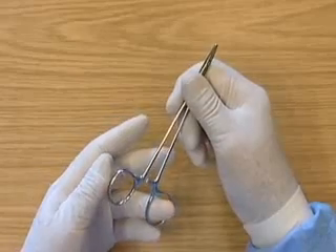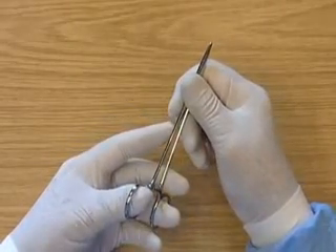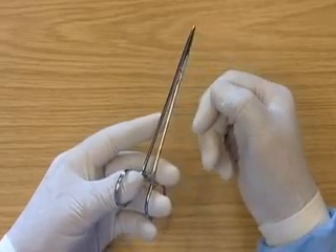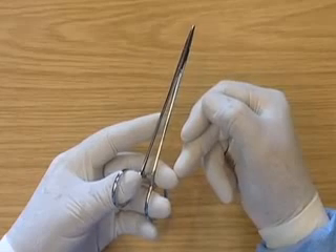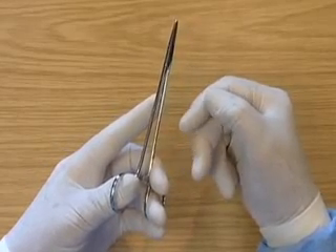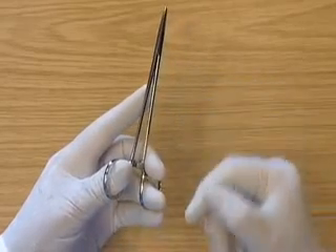The third finger is put through one ring of the holders. The thumb is put through the other. The second finger is placed to support the needle holders. The first finger is directed down the needle holders and the little finger is against the ring here to support the needle holders.